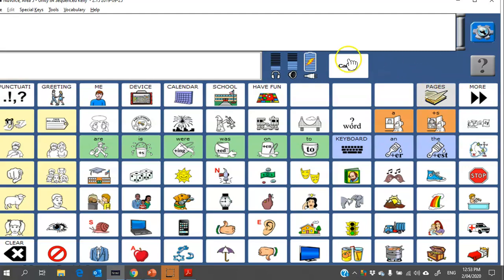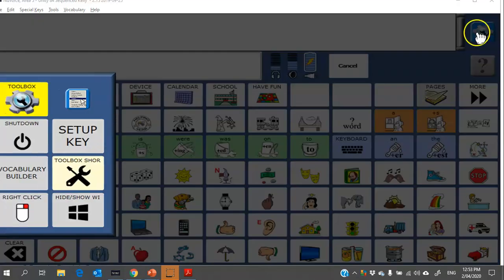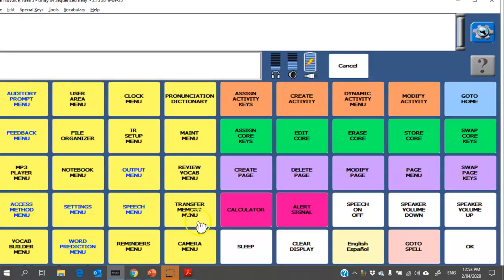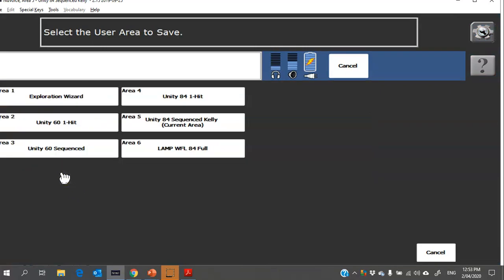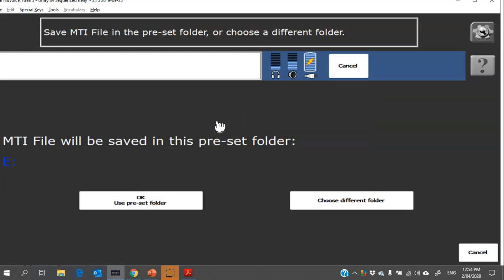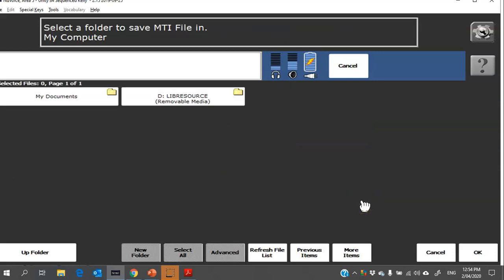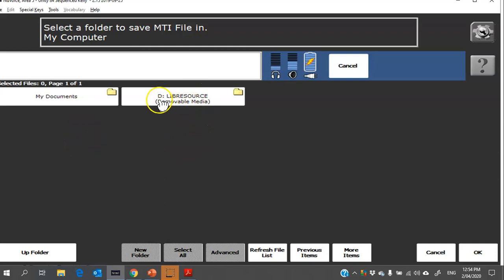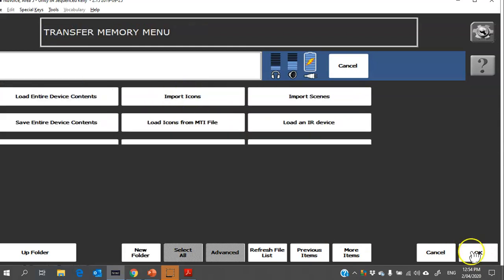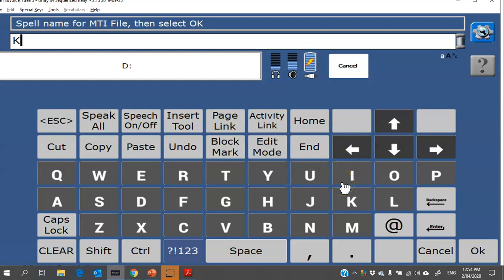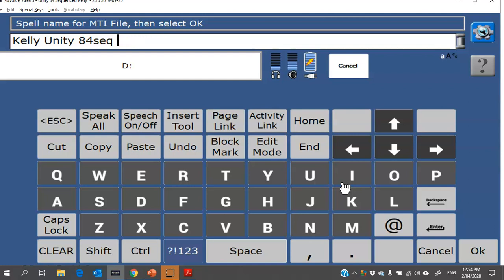So if I wanted to save this user file with the games and people that I've already loaded in, I can click on toolbox, yellow toolbox, transfer memory menu, and in this case I'm going to save one user area. I'm going to choose the one that we relabeled before, and then it's going to ask you where do you want to save this folder. So I'm going to say here I'm going to choose a different folder, and then you might save it on your computer in your My Documents, but I've got my USB stick here which is the D drive. So I'm going to click on that, click OK, and then I'm going to give it a name. So I'm going to call this Kelly Unity 84 Sequenced, and normally I would put the date: 0204 2020.